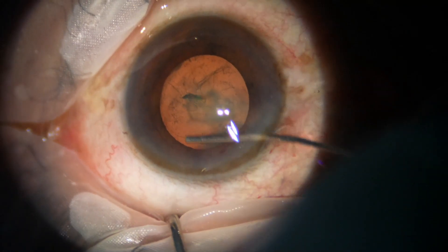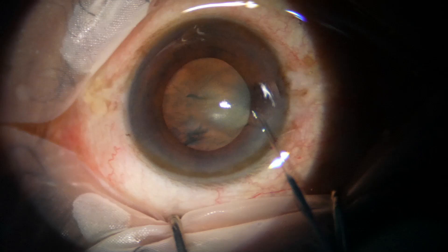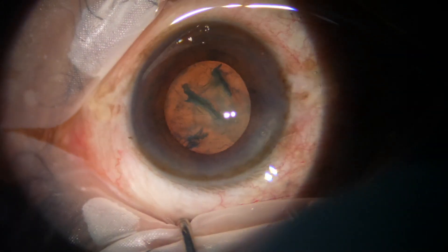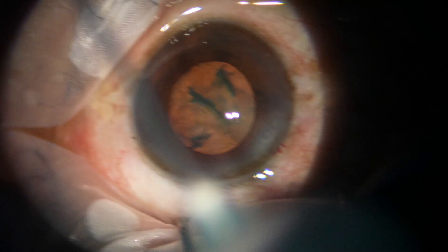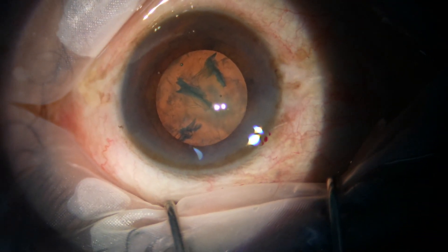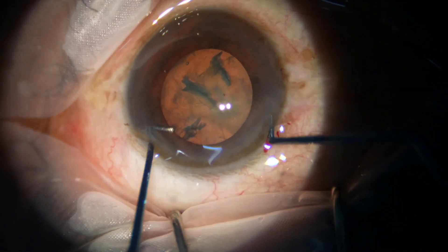In some cases, when the pupil is small, in some areas we have to go beyond the margin of the pupil to get an adequately sized rhexis. Hydrodissection is done. The nucleus is attempted to mobilize, but it was not rotated nicely.